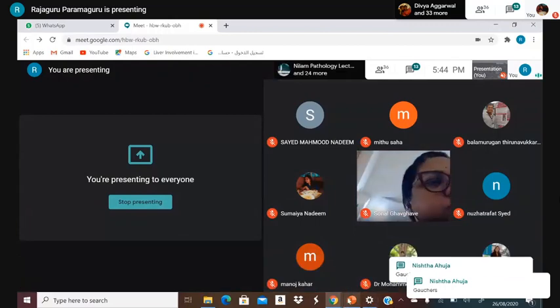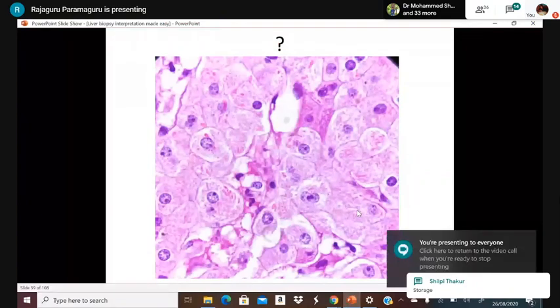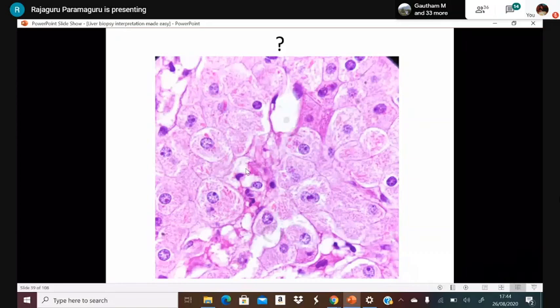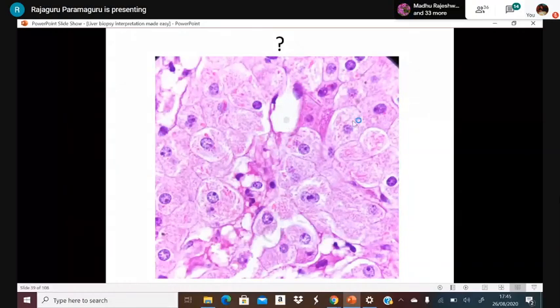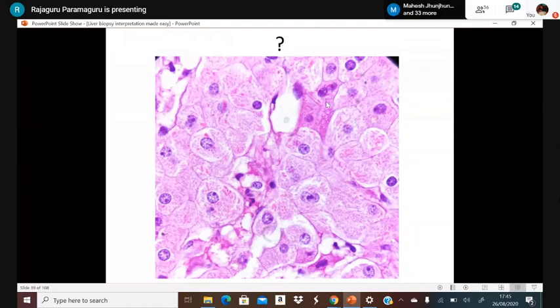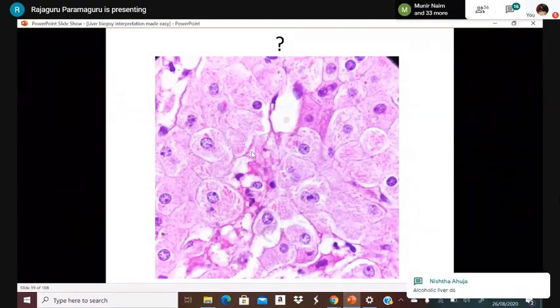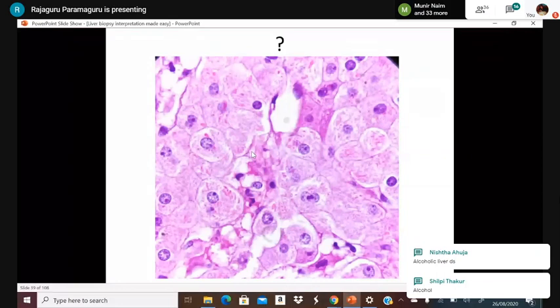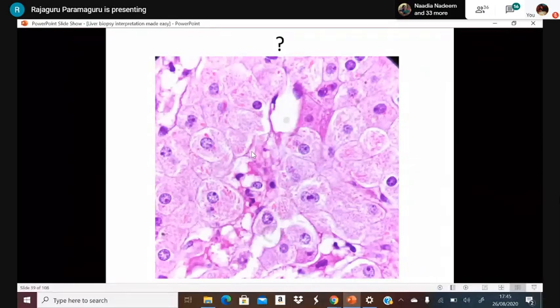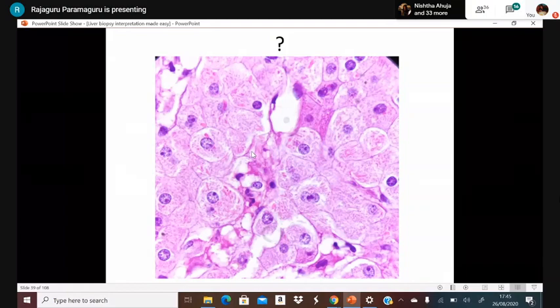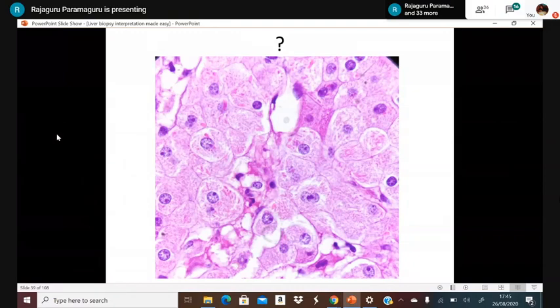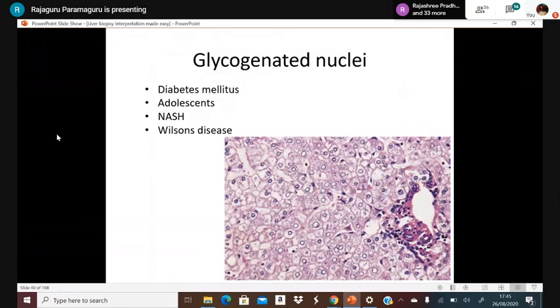Mega mitochondria: these appear as long rod-like structures within hepatocytes. They can be seen in non-alcoholic liver disease (NASH), Wilson's disease, and pregnancy-related conditions. In alcoholic steatohepatitis, examiners may ask about the presence of mega mitochondria.